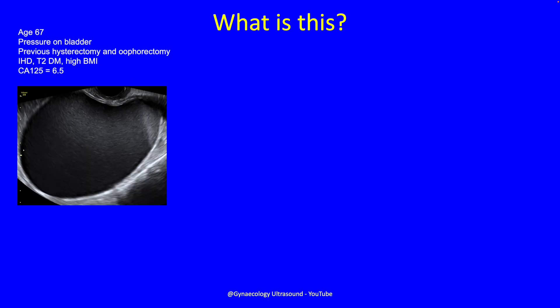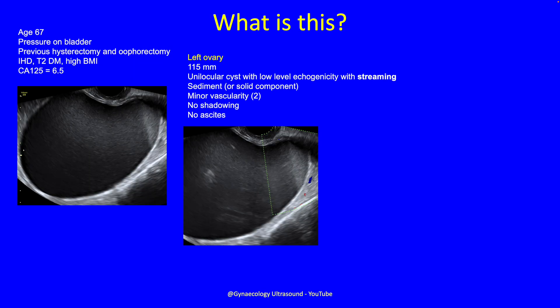So what's this? This patient attended a clinic aged 67 with a feeling of pressure on her bladder. She'd had a hysterectomy and a single oophorectomy. She had ischaemic heart disease, type 2 diabetes, and a high BMI — essentially a high-risk patient with a normal CA125. On transvaginal ultrasound, her remaining left ovary was 115 millimetres: a unilocular cyst with no solid component, a little sediment, low-level echogenicity with streaming, no vascularity, minor vascularity in the cyst wall, no shadowing, no ascites.